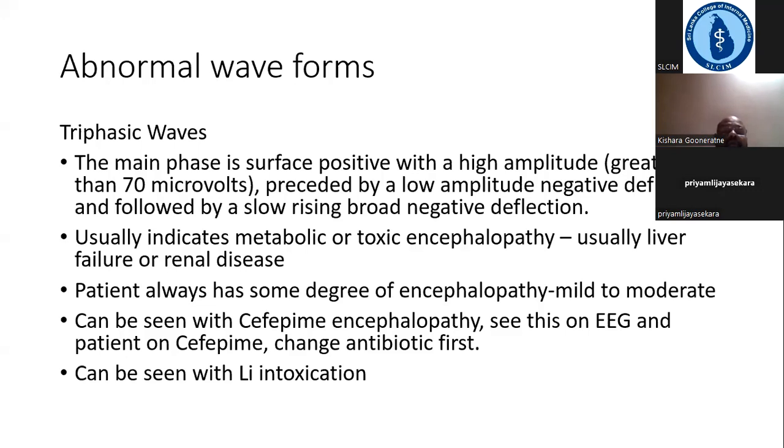A patient with triphasic waves may have mild to moderate encephalopathy. It can be seen with certain drugs such as cefepime, and also lithium intoxication. Of course, the typical causes would be toxic encephalopathies, and also liver and renal diseases causing metabolic encephalopathy.